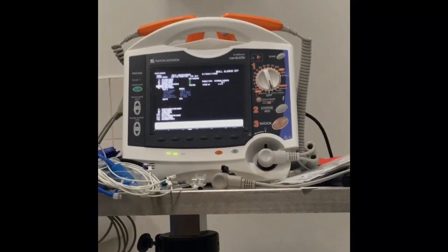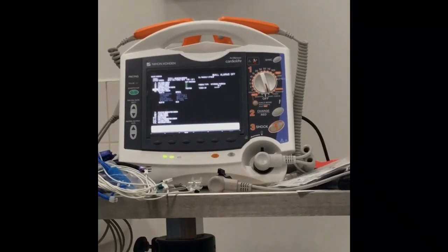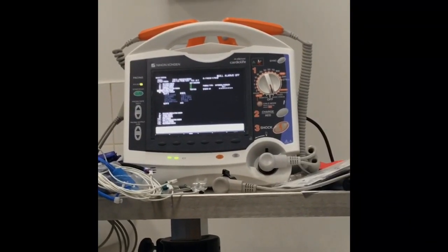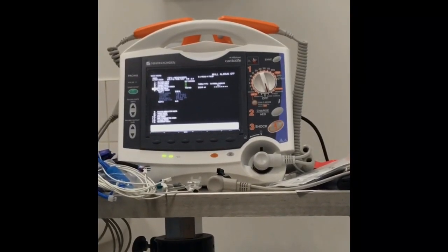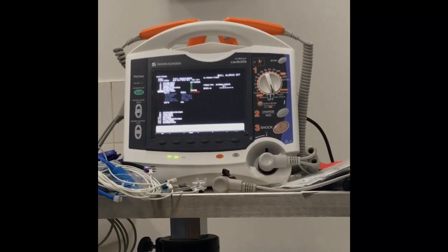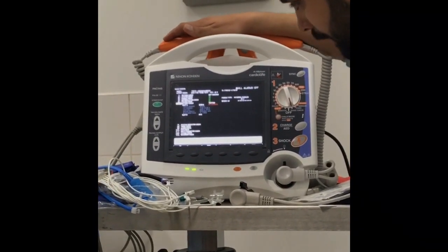The machine is giving me a battery not calibrated message, so we have to do calibration for the battery. It will take 6 hours. Once I finish from here, I will switch to the calibration mode. Then the machine asked me, calibrate battery? I will not calibrate it now because it's taking time. We will complete the basic check.